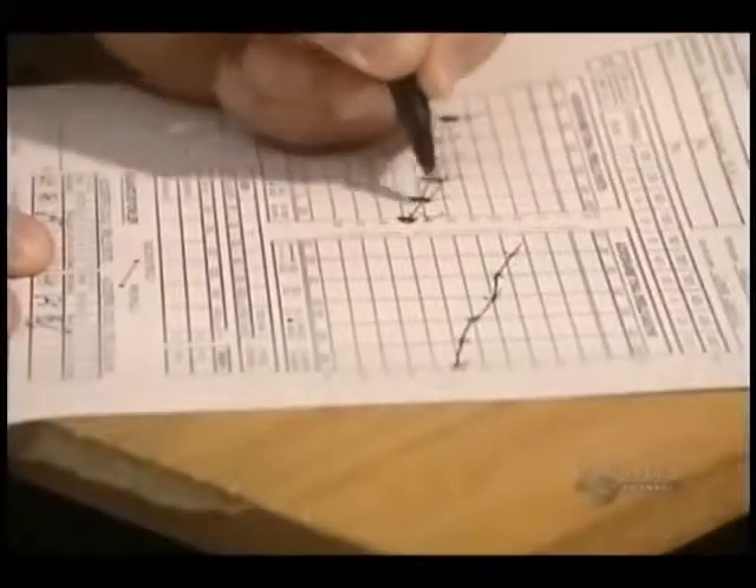Loss of hearing causes a serious handicap, but happily it can be remedied thanks to hearing aids. But before fabricating the aid, the degree of hearing loss must be precisely measured with this apparatus called an audiometer.